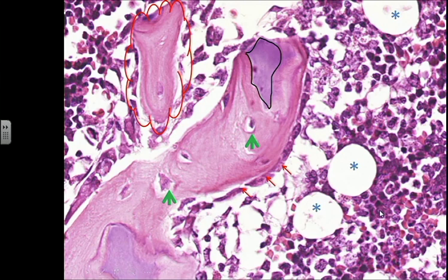That very dense purple color usually represents the nucleus of a cell, because the purple represents the hematoxylin part of the stain that the pathologist uses, and it has affinity for DNA. So it stains the nuclei of the cells. It means that away from this bone spicule, we have a lot of cells over here and over here. These cells represent the bone marrow.